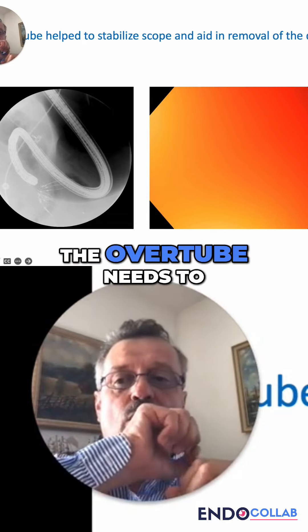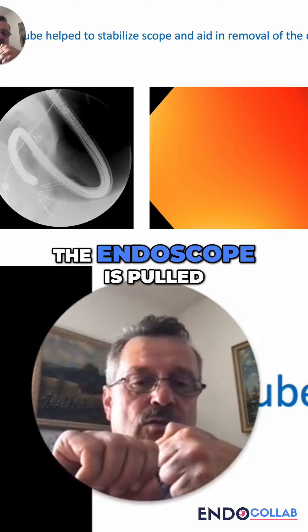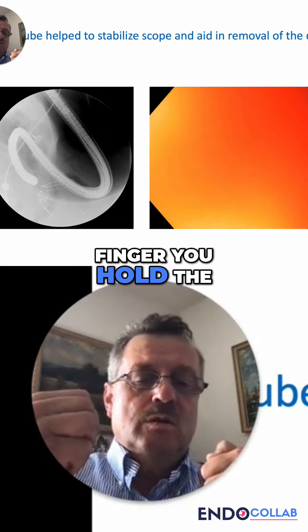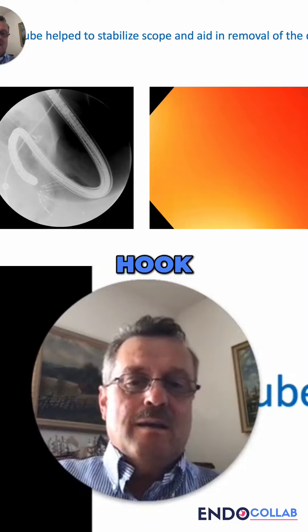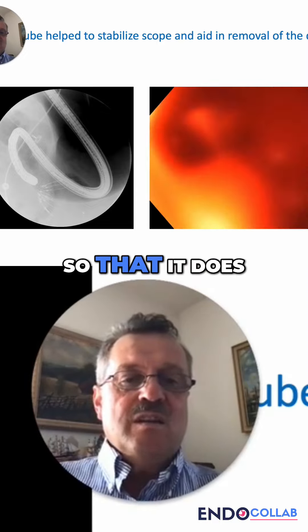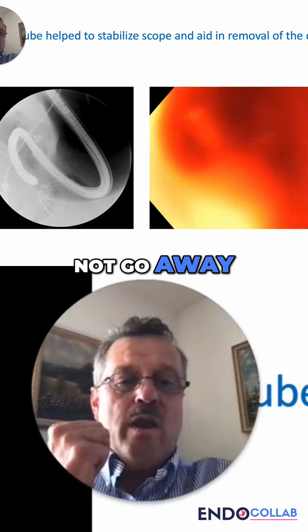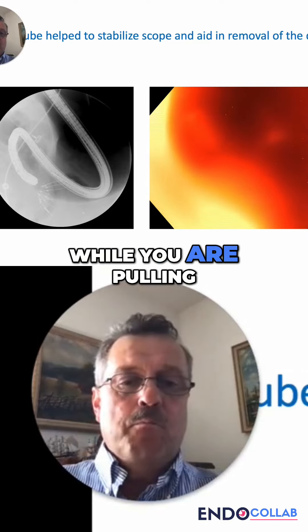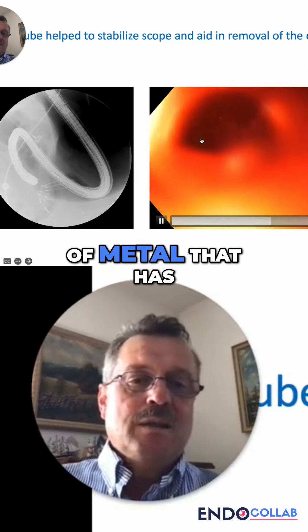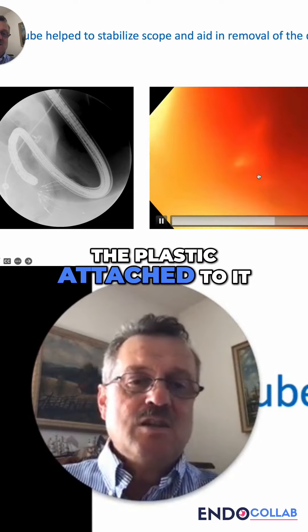The overtube needs to be pushed, the endoscope is pulled, and with your little finger you hold the hooking device so that it does not go away while you are pulling all of this crown of metal that has the plastic attached to it.